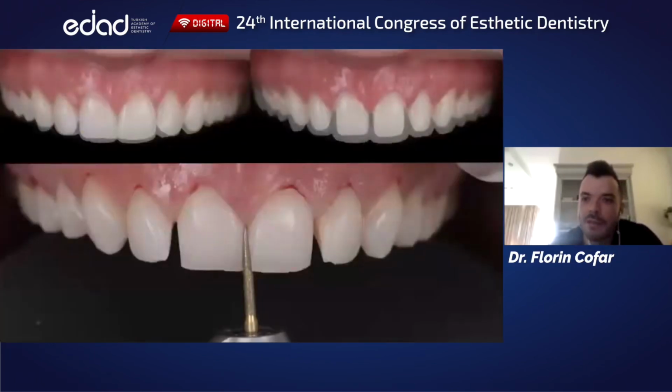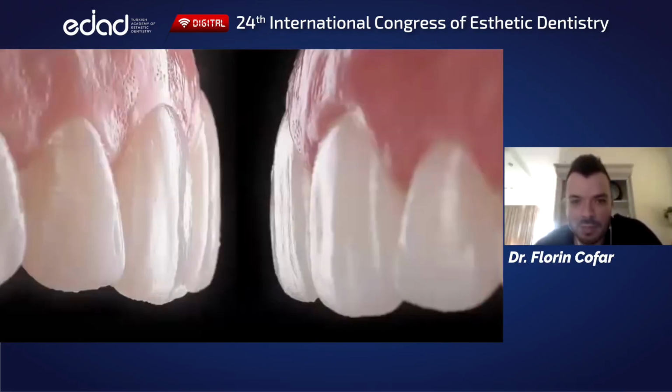Just create the right amount of space for the ceramics. Here, the prep is minimal, except that we have to open contacts between centrals and laterals, because you have that tooth position issue, and it's going to be impossible to create a nice contact in ceramics unless you cut the contacts there. So you can see the narrative is always, you select a library and you always follow the library.